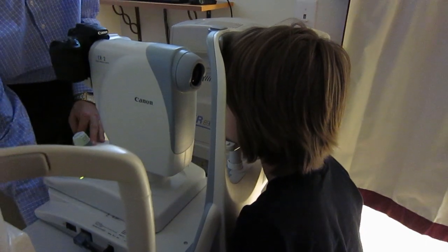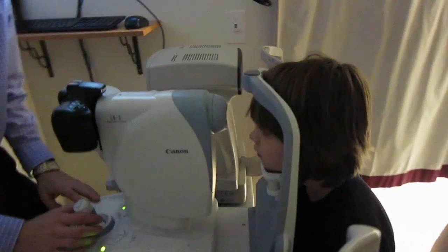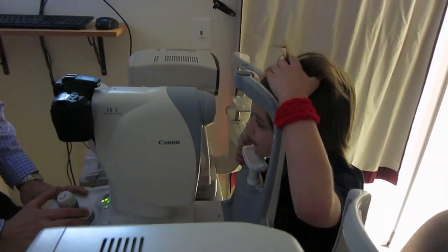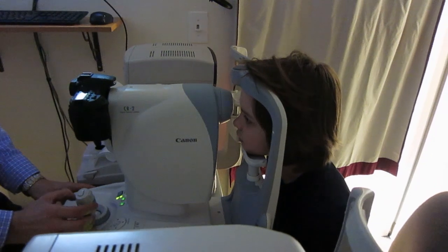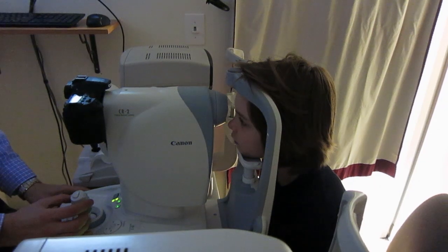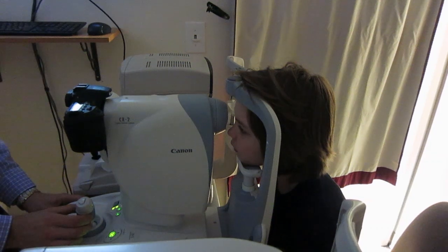This is like a big camera, so it's going to take a bright flash of the back of the eye in just a moment. Let me set it up here. I'm going to have you brush your hair back a little bit. So looking right in there, you're going to see a green light — look right at that. Keep blinking as you need to, and then once I line you up I'll take a big camera flash.